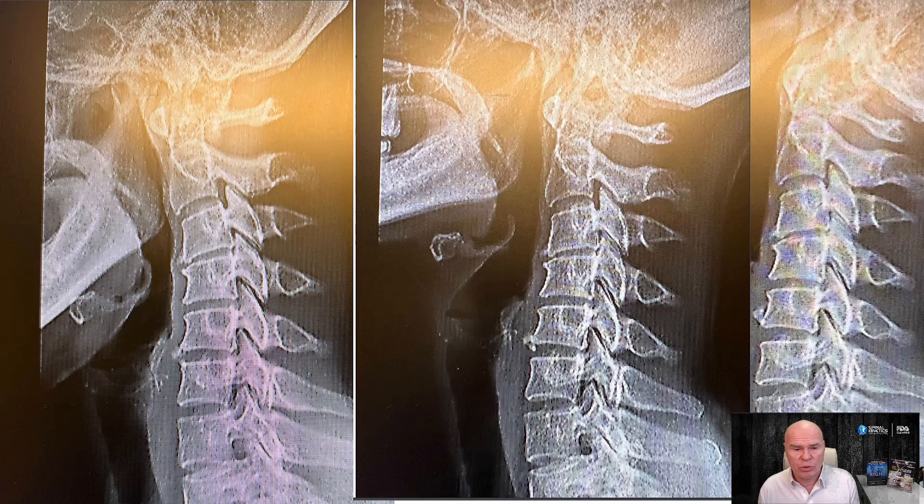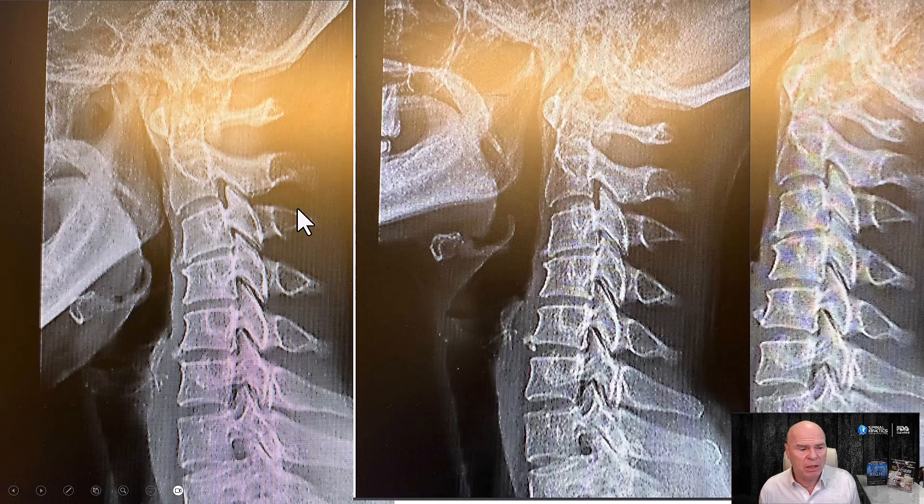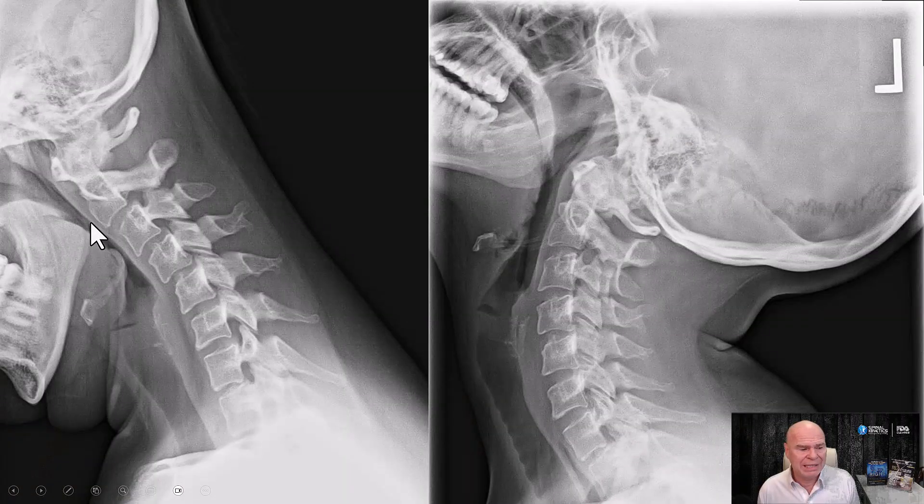The neutral in this case is fine. But if we're looking at flexion and extension, this is what we want to see. If you look at the patient above, we don't see a lot of flexion — the flexion is in the head, not in the neck. What we want is neck flexion and neck extension.